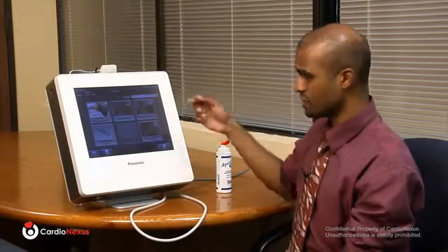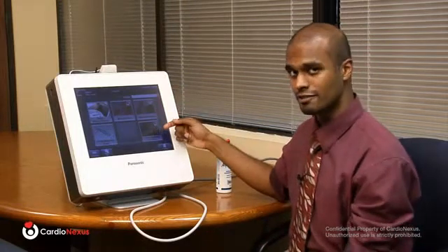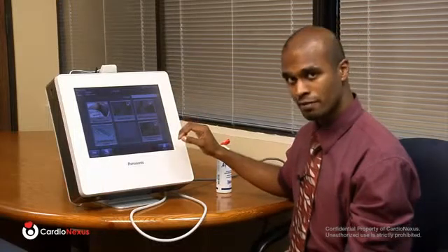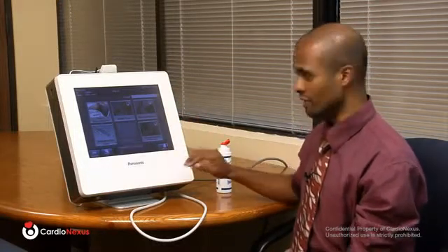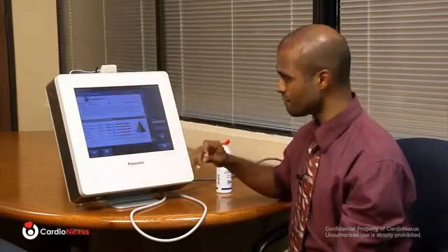So now that we've completed the ultrasound scanning procedures, you'll notice again a third check mark here next to the application for ultrasound. And at this point now you've completed all of the minimum requirements to see a CardioHealth report. So simply choosing the report button will combine any information entered onto a 4-page report, which can be printed in color and handed to the patient.